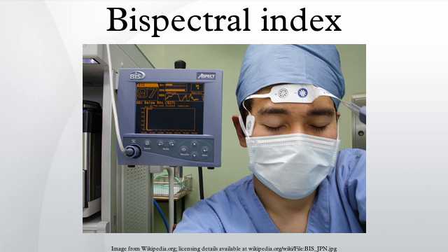Some studies show a greater incidence of intraoperative awareness in children, when compared to adults. The correlation between bispectral index in children over 1 year and state of consciousness has already been proven, although in younger patients the monitor is unreliable because of the differences between immature infant EEG patterns and the adult EEG patterns that the BIS algorithm utilizes.